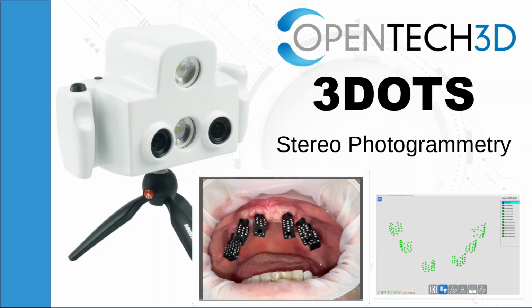In the dental sector, photogrammetry can work alongside an intraoral camera to compensate for its poor accuracy when working on extensive restorations, especially on implants. The presence of tissue between one implant and another, as we all know, always causes imprecision in the location of the implants, if you work with the intraoral camera alone. And imprecision then translates into remakes, adjustments, various tests that must be done in the patient's mouth. In essence, it translates into lost time and money, and an unsatisfied patient. Photogrammetry avoids all of this.